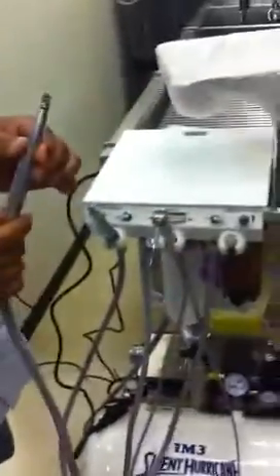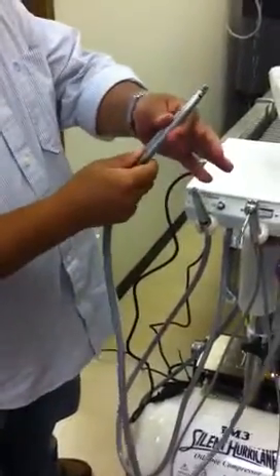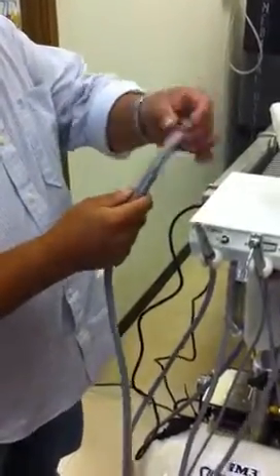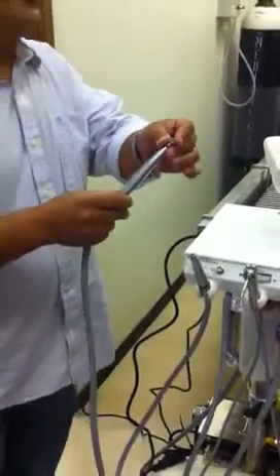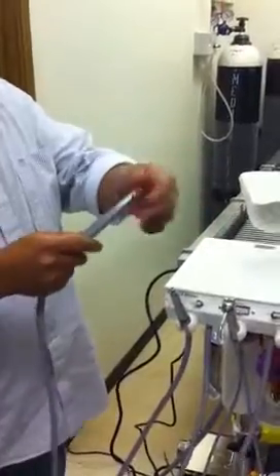This would be the high-speed handpiece. The high-speed handpiece features LED. Bear in mind, although this is a good technology to have, it is more important that handpieces are maintained, and also you need to understand the mechanism behind it.